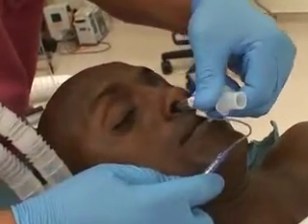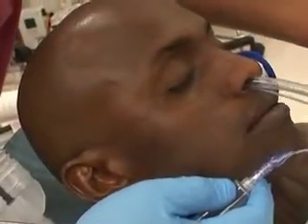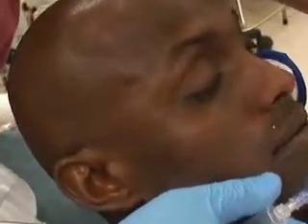Endotracheal extubation is indicated when the clinical conditions that required airway protection with an endotracheal tube or that required mechanical ventilation are no longer present.